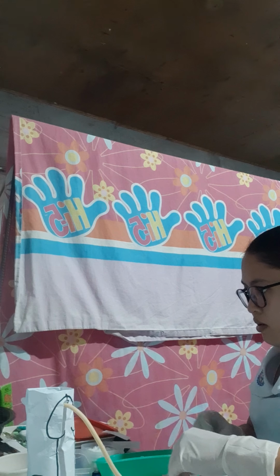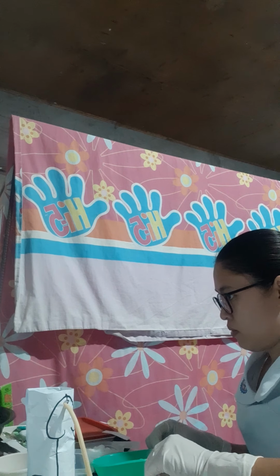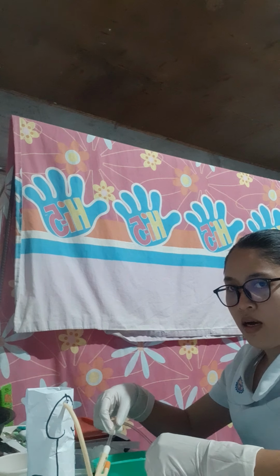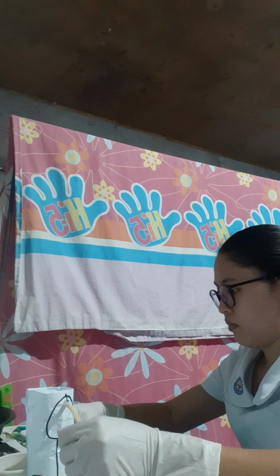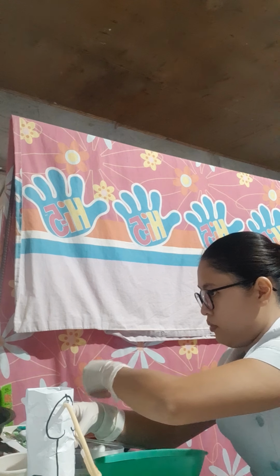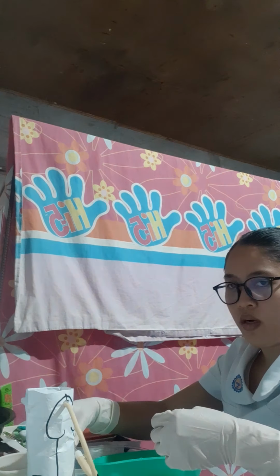Lower. Then we're going to tape the tubing on top of the thigh of the client, or lower abdomen.